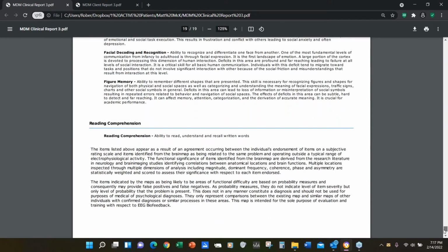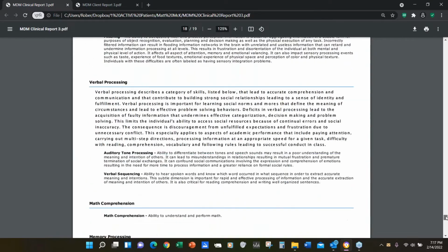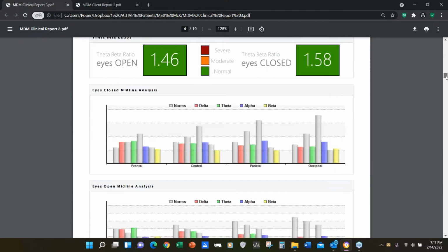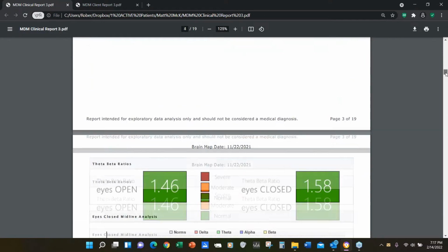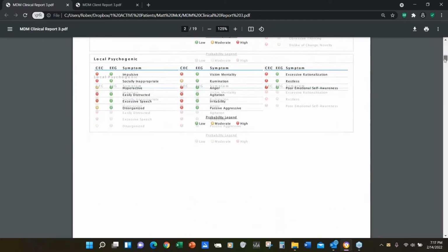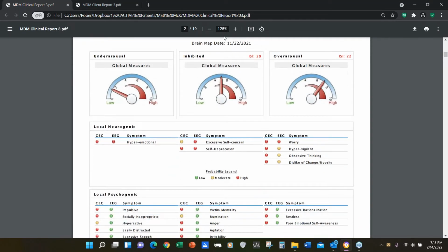As I say here pretty regularly, I'm not the most technical speaker when I talk to the clients. But I polled my team today, the people I work together with, my techs and all, and we all seem to agree that people are very satisfied with the conversations I have with them. So I thought, do I need to be more technical? And basically, when I first go into the physiology, I think that's really important. Can we talk about that first, or should we stop here? Because we might get sidetracked. I want to make sure this stays useful for people.